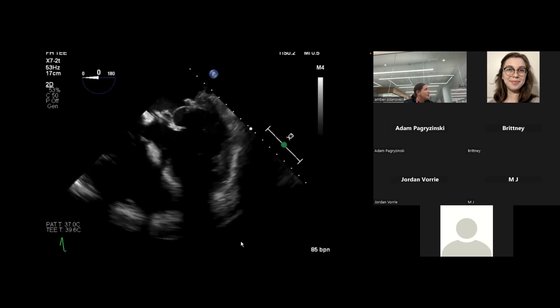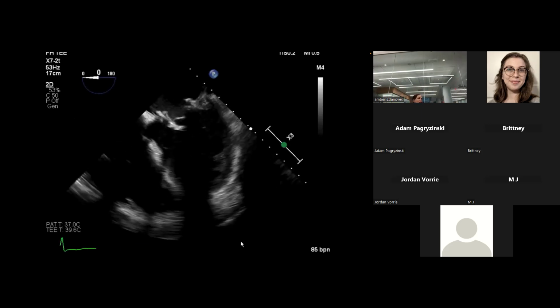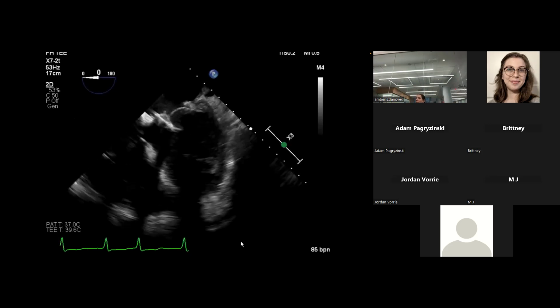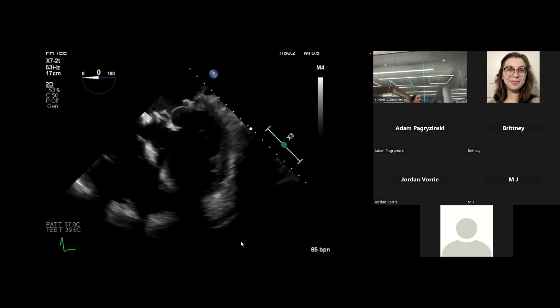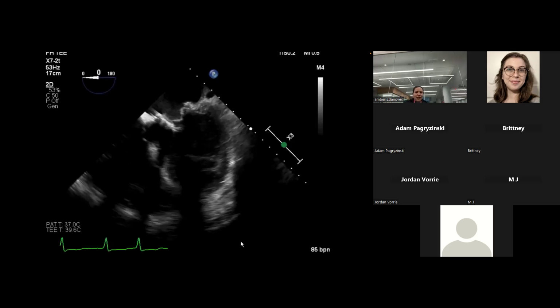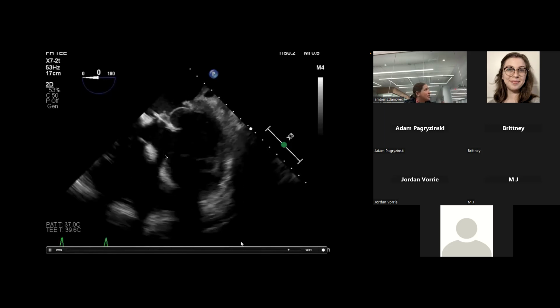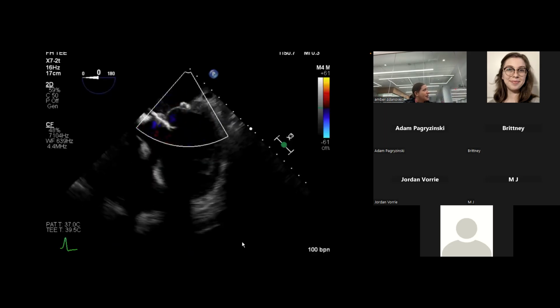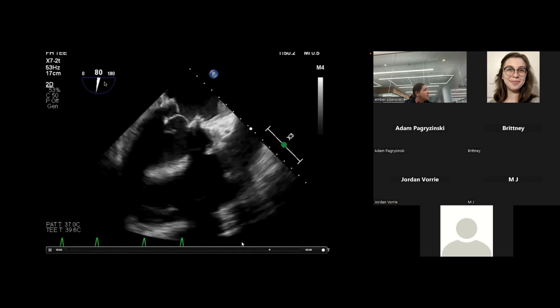All right, so you put the probe in. This is what you see. Remember, he's getting worked up for a transplant. So first of all, what is in this man's past medical history that you can tell just from this? Okay, so he has heart failure, but I should say surgical history. Is it a mitral valve something? Yeah. So if you look here, this is the 4 chambers. So this is a mitral valve right here. And we'll look at it in another picture here, and then we'll determine if it's bioprosthetic or mechanical. All right, so we throw some color on there. That doesn't look terrible.